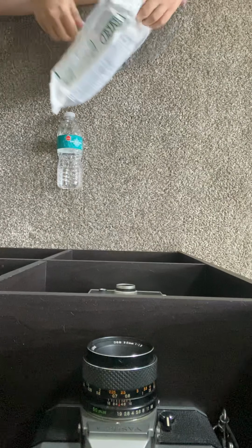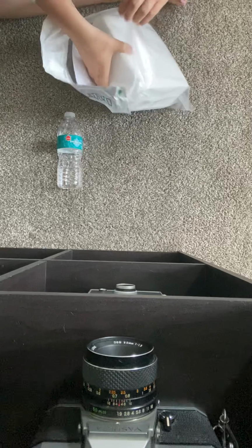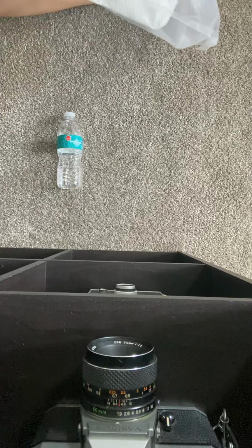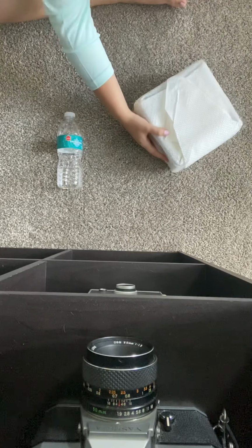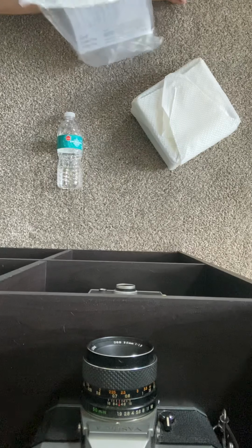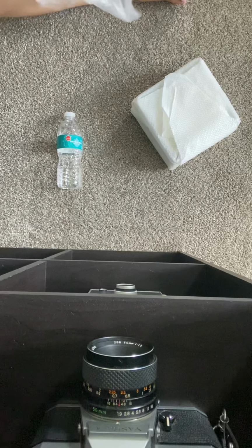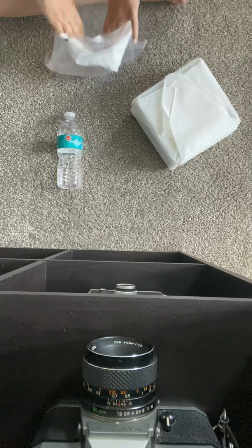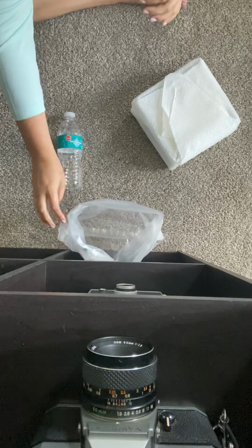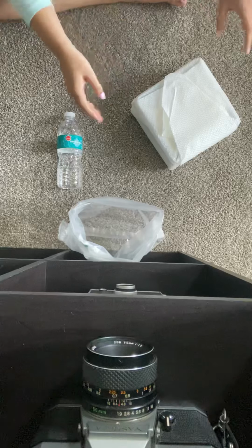So I'm going to just pull this tab, and then I'm just going to remove this. This would be like a sanitized thing. And then I'm going to save my bag and use it as a trash can, because I think that's the easiest. I don't know if you can see my trash can or not. I think you can. Okay, sorry, I just want to make sure you can see everything.